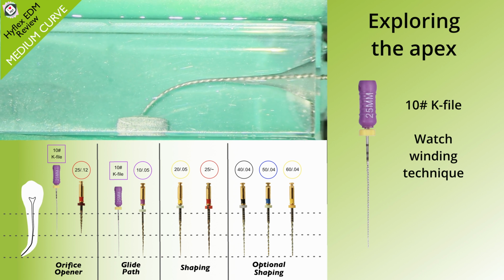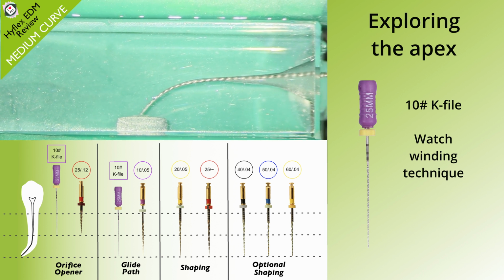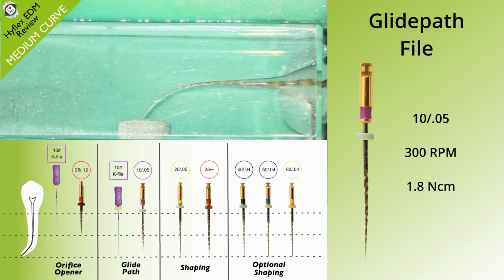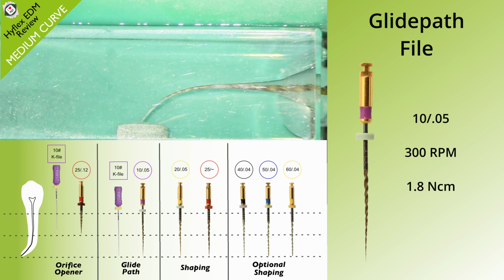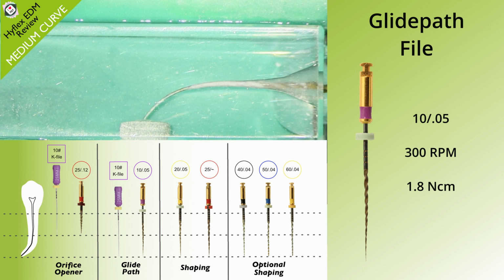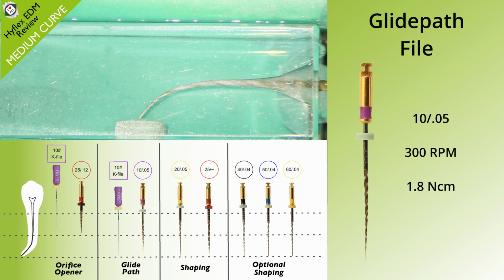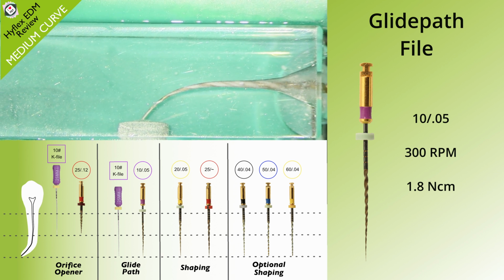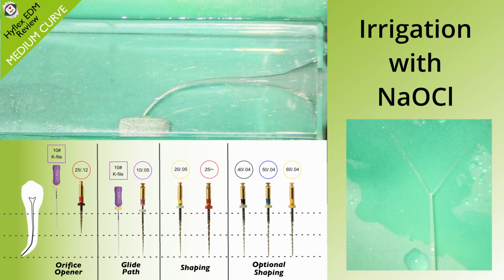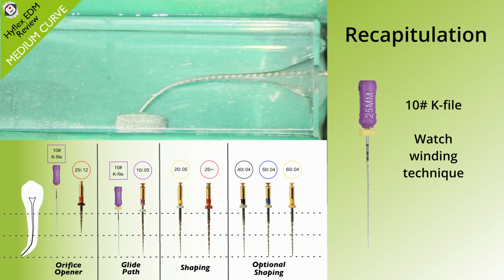Irrigation with sodium hypochlorite. So once we've opened up the orifice, we're going to then explore the apex with a size 10K file using the watch winding technique. We're then going to use a size 10 Glidepath file. Now this doesn't go as easy to length as the simple curve set, so you just need to be really judicious with your pecking here.